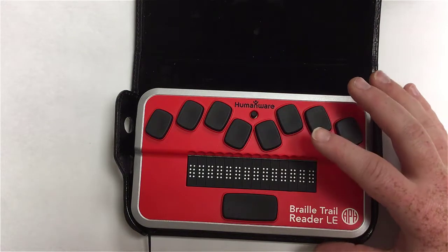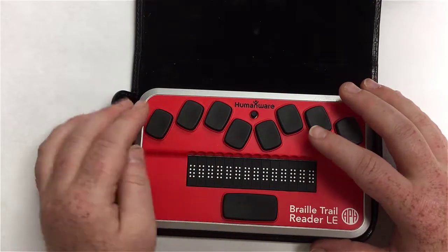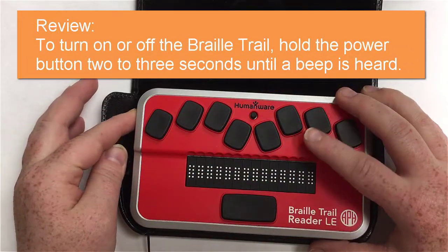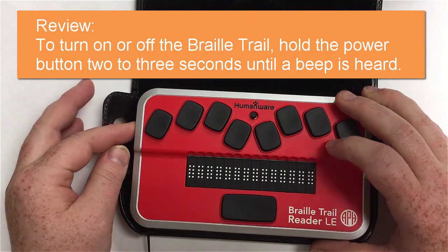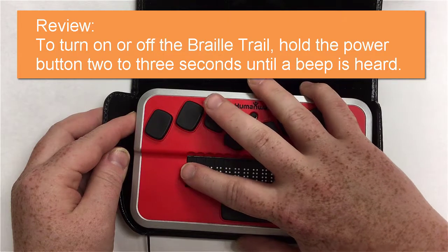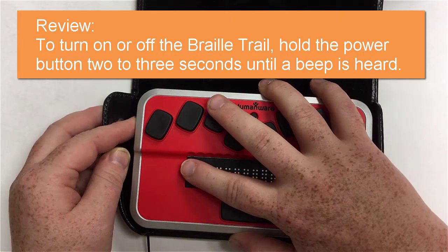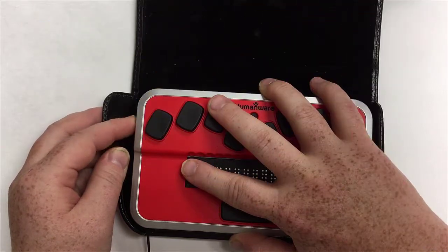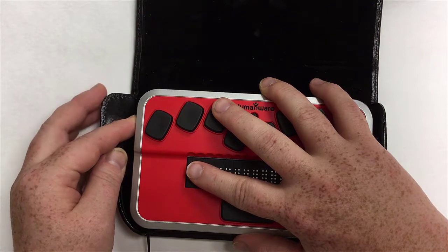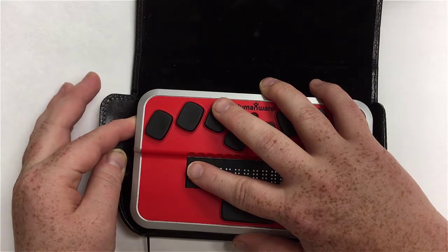To get started, we need to turn the unit on. The power button is on the left side of the unit, on the part facing away from you. Hold it in for about three seconds. While holding it in, put your finger on the Braille — if you have a hearing loss or don't hear the beep, you can find out it's turned on by feeling the Braille has popped.